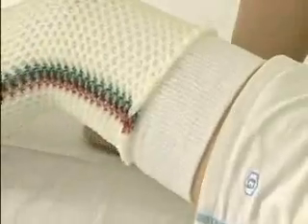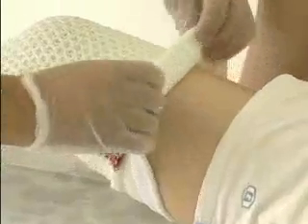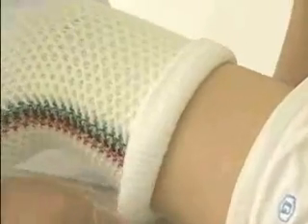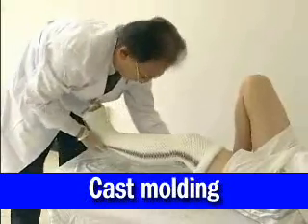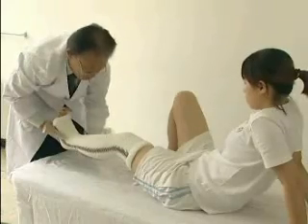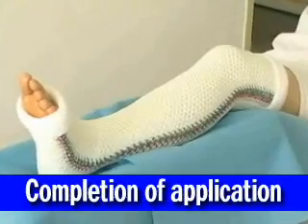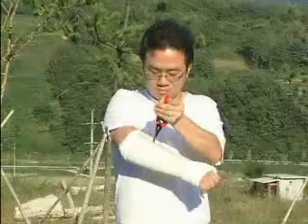Leave 5 centimeters of the protective lining uncovered at the top and bottom so that it can be rolled up and over the cast molding later. Next, fold both sides of the protective lining up and over the cast and smooth it out using the hands so that the surface is smooth and wrinkle-free. The patient should be in a comfortable position and keep the affected limb immobile for 5 minutes while the molding dries.